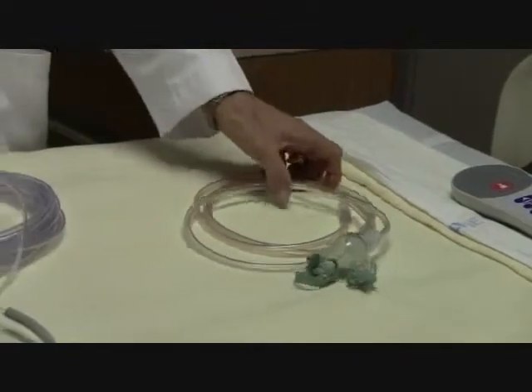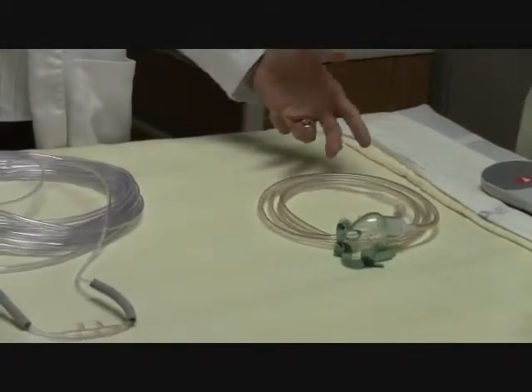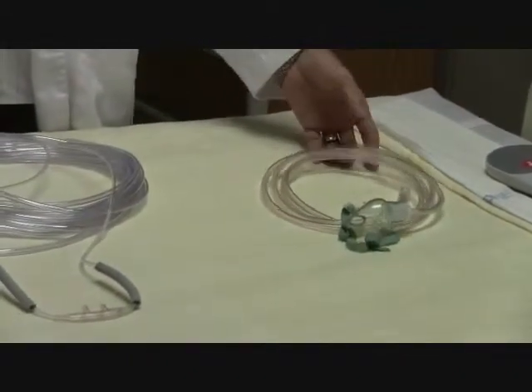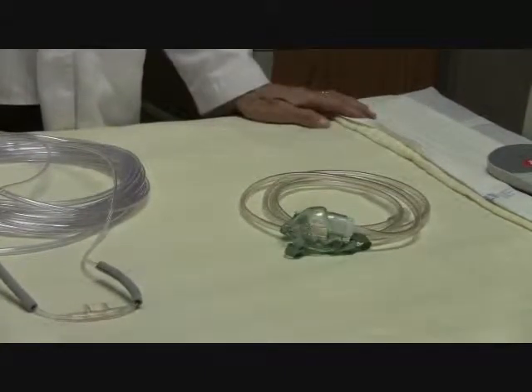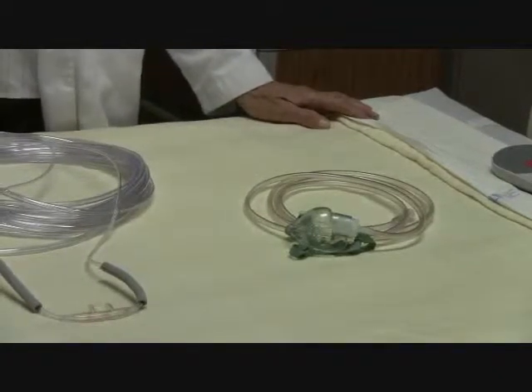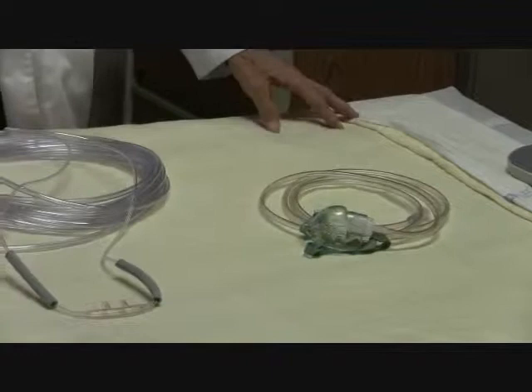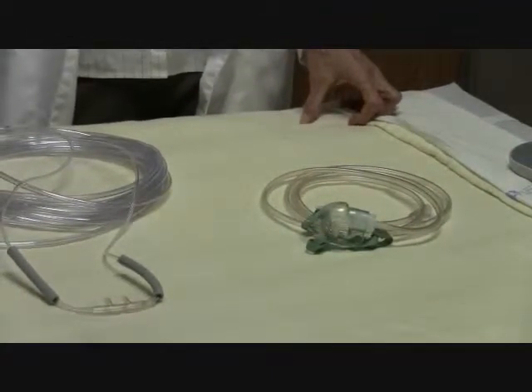The advantages of using a simple mask are for those patients who have had some sort of nasal obstruction, some kind of nasal surgery, or for patients who are prone to mouth breathing. One of the disadvantages of using a simple mask is that it makes it more difficult for the patient to eat.